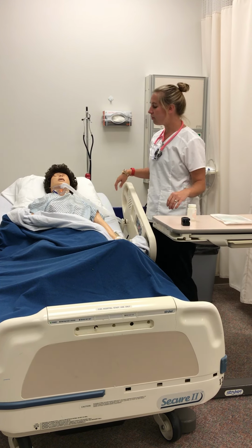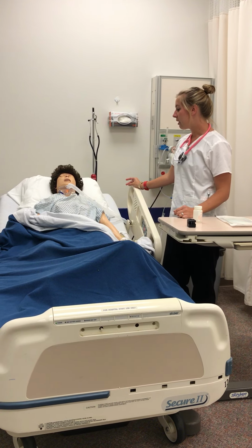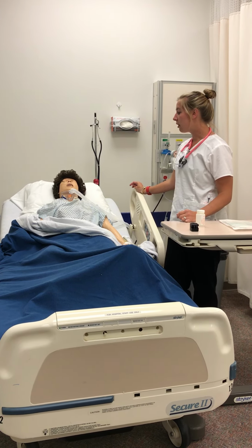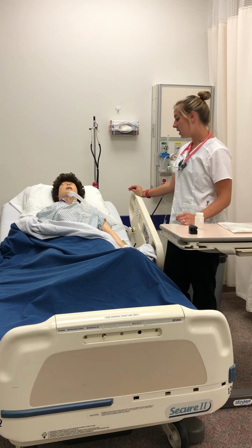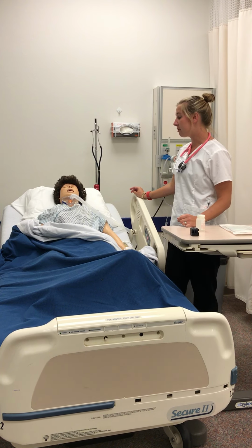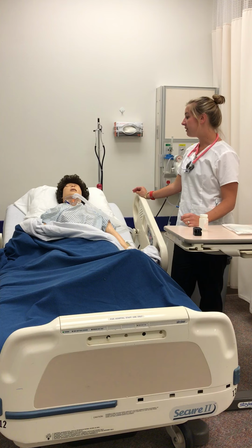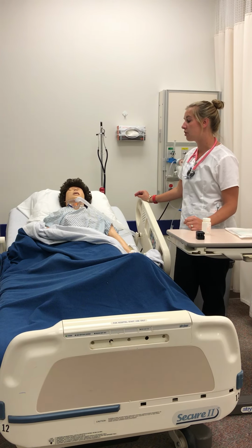All right, because we've had some complaints of Gretchen being agitated, and right now I can hear that her breaths are kind of rattled, that all leads to the conclusion that she'll probably need trach suctioning, but also that her respiratory rates are a little low. They're at 10 breaths per minute, where they should typically be between 12 and 20, and her heart rate is elevated to 105, where that is typically between 60 to 100.